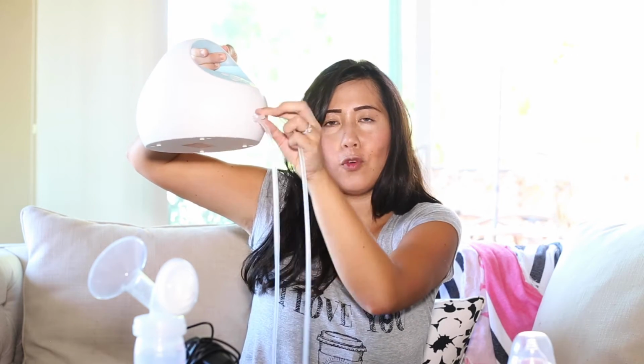The other thing I wanted to mention about this is if you want to pump just one breast, like to save time, if you're nursing one breast and you want to pump the other breast. So it comes with 2 tubes, and the 2 tubes go one on top of the other. And when you get it, there's going to be this little knob piece right here that goes over one of them. So if you want to pump just one breast, you have to remember that you have to cover this top hole right here, and then use the bottom one to pump whichever breast you would like. So that's just one thing that you have to know about. I know with my Vince one I didn't have to do that, but for this one you do.